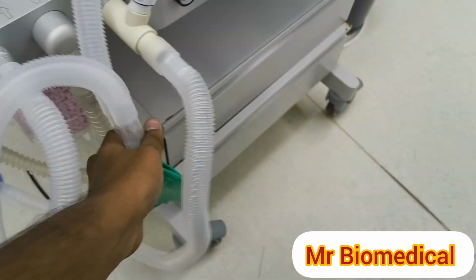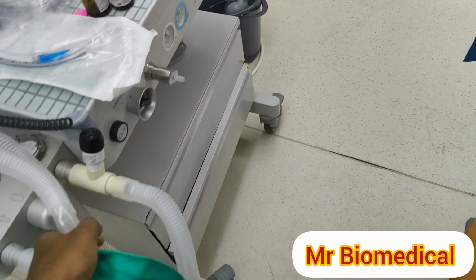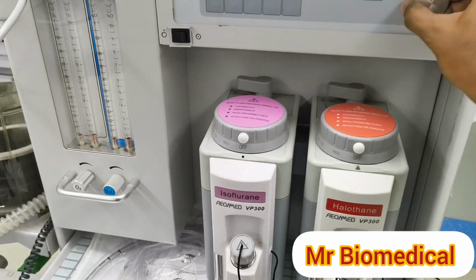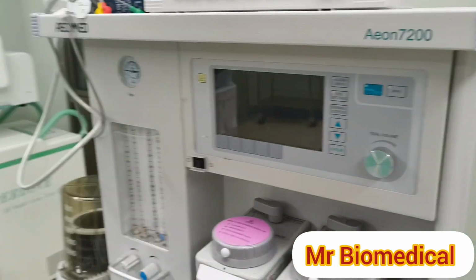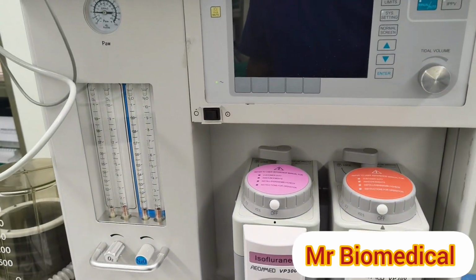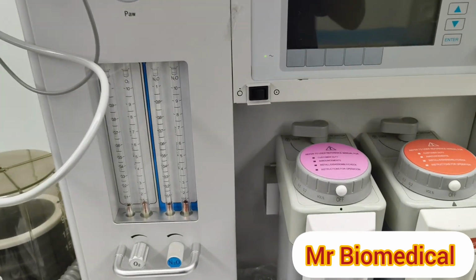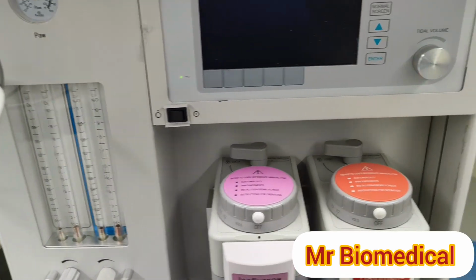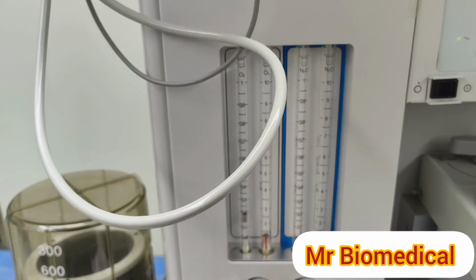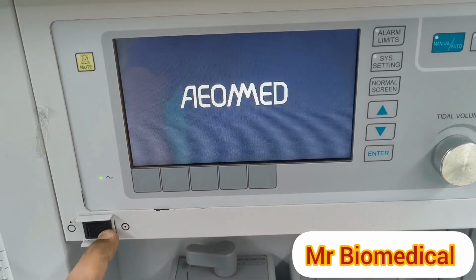Okay, so I got a reservoir bag here. How the anesthesia machine works: whenever the patient needs surgery, or has to be in deep sleep, the anesthesiologist uses the anesthesia machine, with manual or ventilation mode. I'm going to tell you what ventilation mode is. First of all, we need to ensure that every gauge is at 0 so that the self test will be passed. So I'm switching it on.